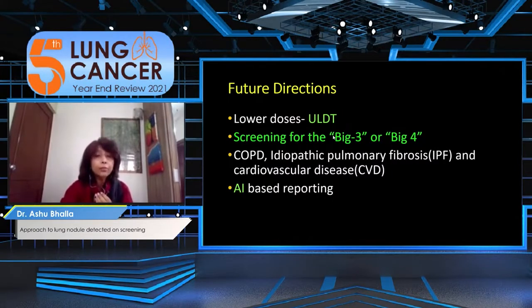Future directions, we are moving towards ULD CT, because we want chest radiographic equivalence in doses. At the moment, ULD CT is not approved for lung cancer screening because ULD CT is not available in most of the scanners across countries because it requires an iterative reconstruction, which is at the moment available only in high-end scanners. It's also being called screening for Big 3 or Big 4, which means that you report all this also on the scan, and AI-based assistance will definitely be required.